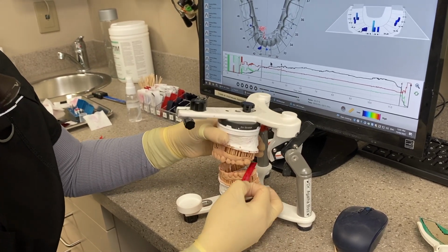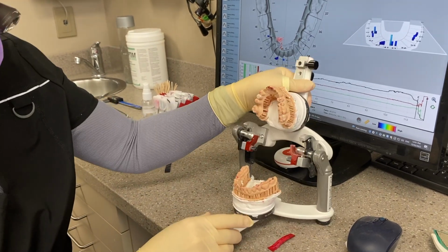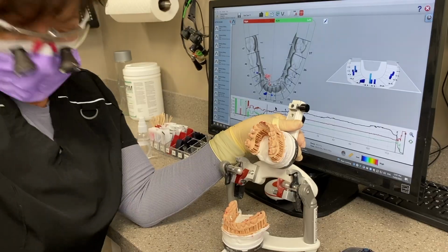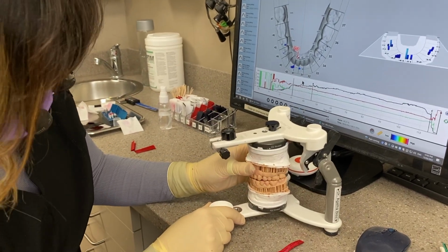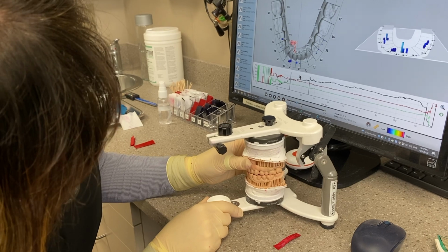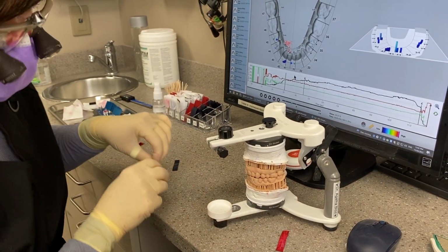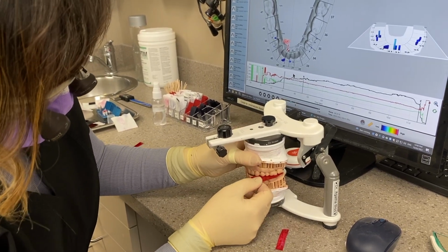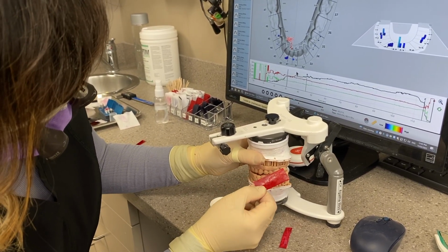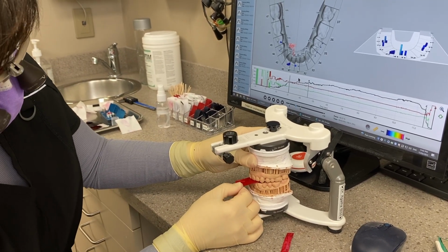Yeah, and now I'm on the cusps again. So I'm picking up lots of interferences on these teeth. Figure out how far, or what it will take to get her to where you want. And if you can't do it, at least you've done it on the models, and then you can talk to the patient about it and see if they want to go that far, or if we need to open her up a little bit.